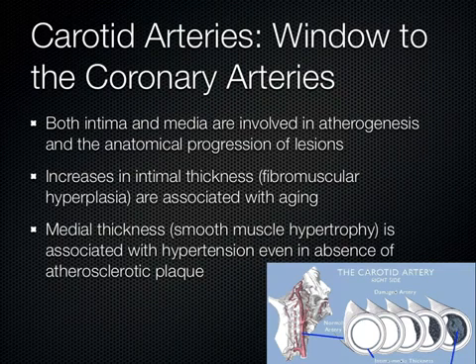Surrogate markers are not perfect, they're not like pathology looking straight at the disease itself, but they are convenient, non-invasive ways of checking for things going on in our patients. Same thing with carotid artery intimal medial thickness, or CIMT.